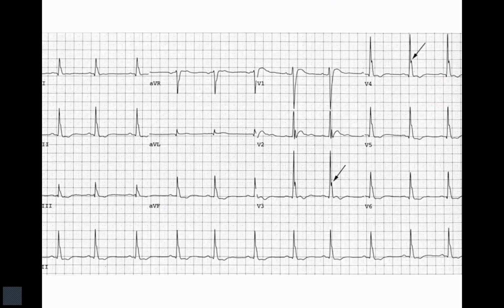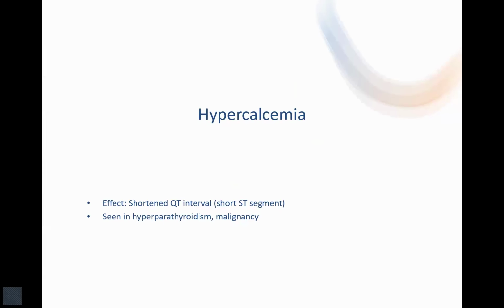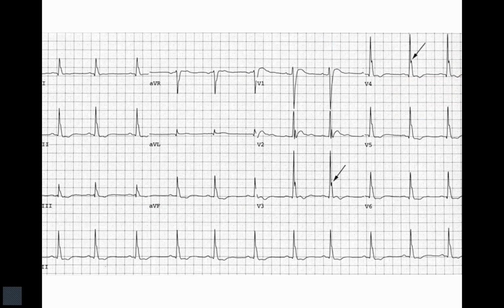So this is what it would look like. In this EKG, there's pretty much a P before every QRS. But if you go back and look at our hallmarks, our hallmark is that shortened QT and ST segment. They have some nice little arrows to show you that. But if you really look at that ST segment, it's particularly short and sometimes has those sloping waves to them.